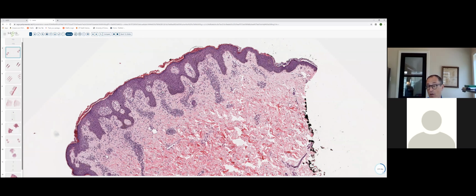This is actually an example of Pityriasis rosea. And in Pityriasis rosea, we frequently get mounds of parakeratosis within the stratum corneum, sometimes containing serum, usually a little bit of microscopic spongiosis within the underlying epidermis. All of this in concert with a superficial perivascular infiltrate of lymphocytes and a lot of times extravasated red blood cells. You don't see the neutrophils that we see in guttate psoriasis or in psoriasis in general. So that is one of the key determinants for distinguishing these two conditions.